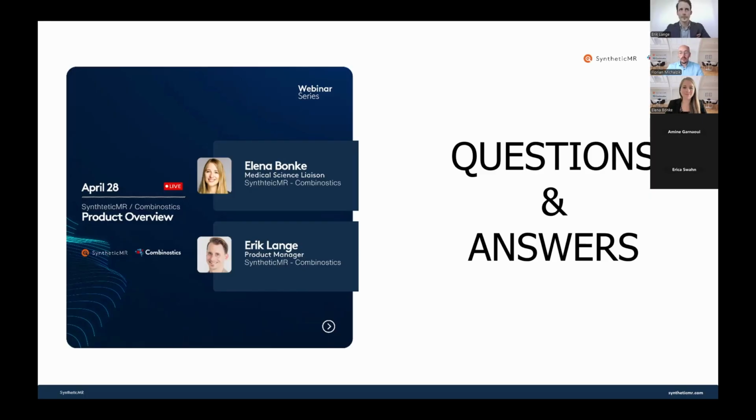Thank you. Maybe to just make sure that we end the webinar on time, maybe a quick answer on another question, which is what is the most valued feature of our technologies, Erik?